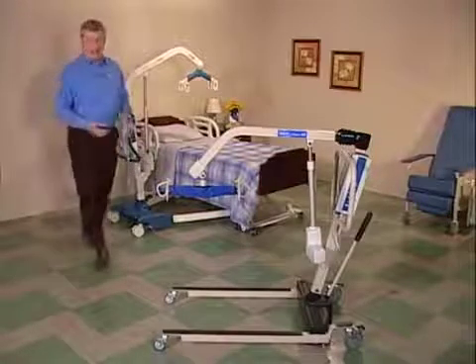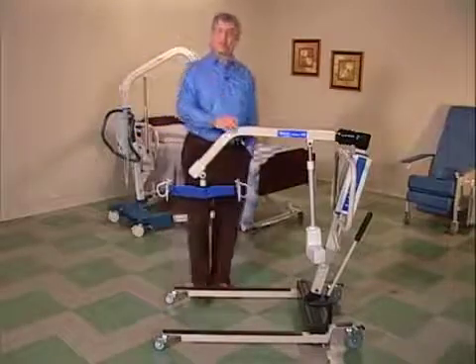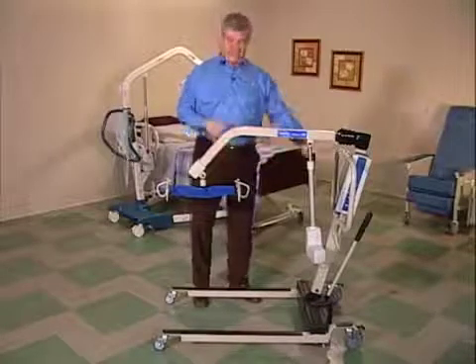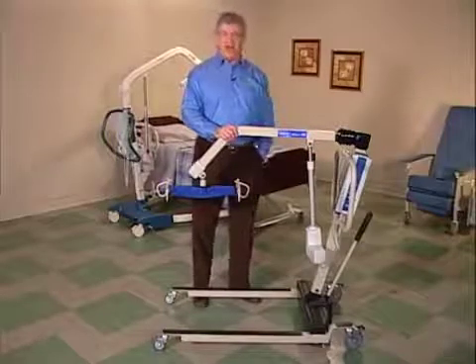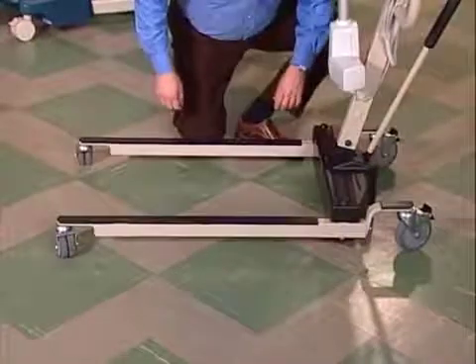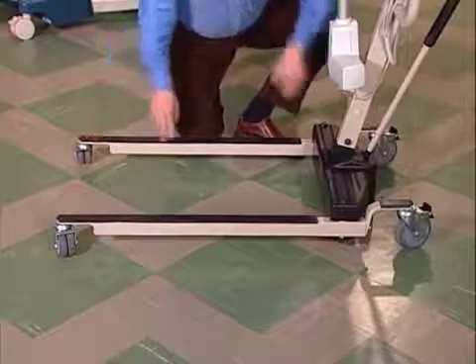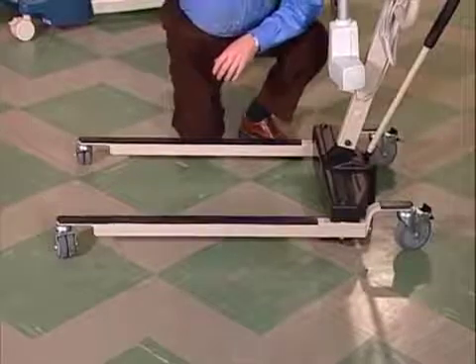To get a better understanding of a Reliant or Jasmine lift, it's good to know the parts. Basically, the lift is made of 3 assemblies: the base, the mast, and the boom. Let's start at the bottom and work our way up, beginning with the base. The base rides over the floor on these 4 low-friction casters. The rear ones are lockable. This is a feature that comes in handy when you're adjusting the sling for initial setup on the patient.